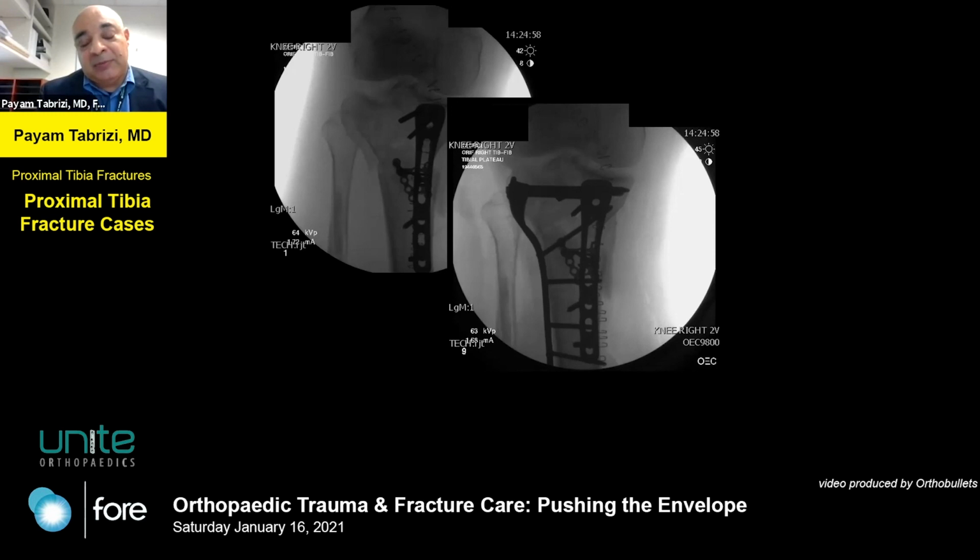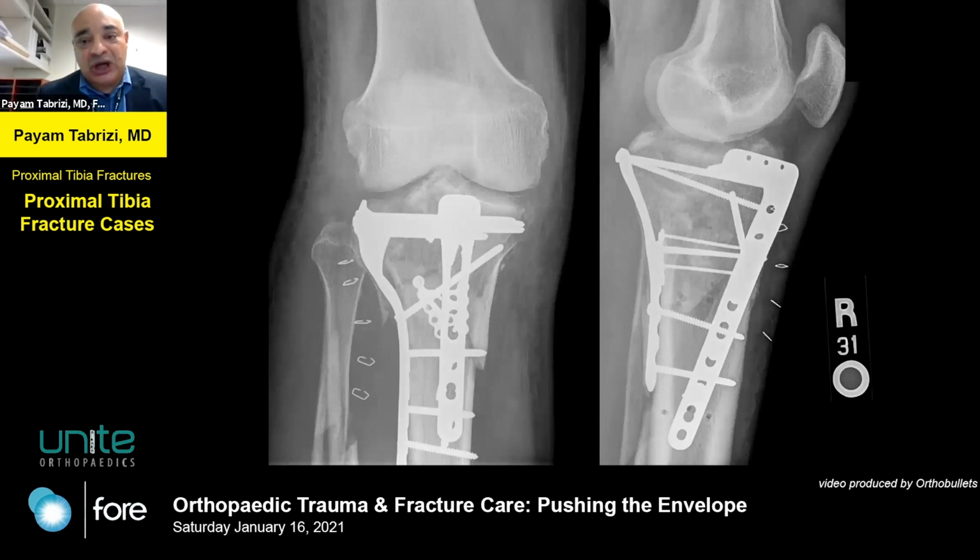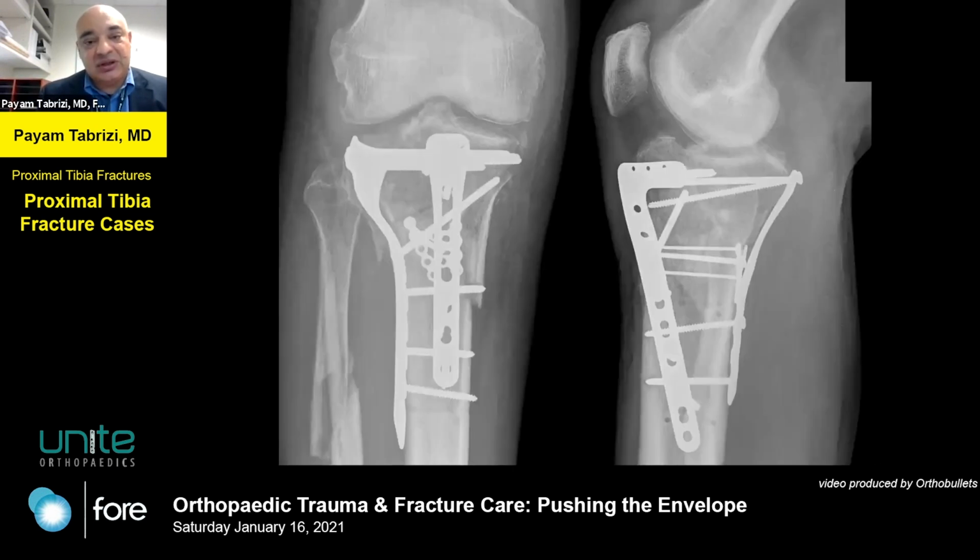The one problem with putting them prone is you sometimes have to take the X-fix off early because you cannot position them prone with the X-fix pins in. Here you can see the plate's way too anterior for the lateral plateau, but that's where most of the fragments were, so that's where I decided to put the plate. Post-operatively, it looks pretty good. Again, the plate is very anterior, but I thought I achieved a good reduction of the joint and pretty good restoration of the metadiaphysis. He came back about 3 weeks later for suture removal.